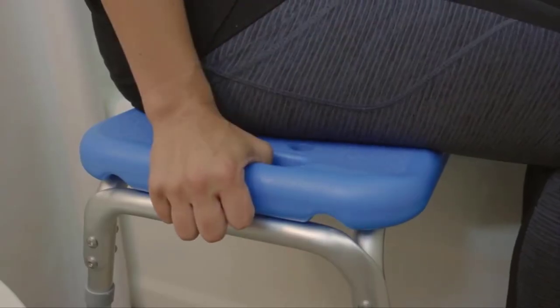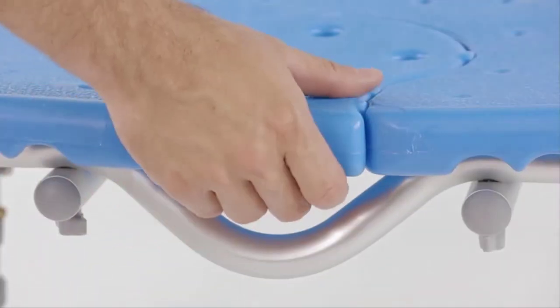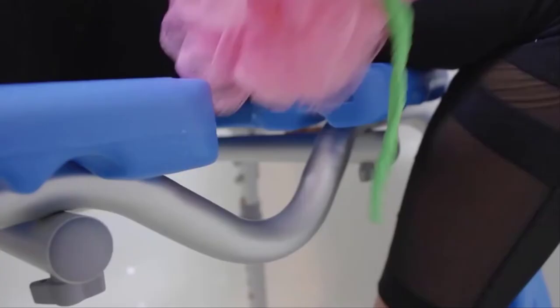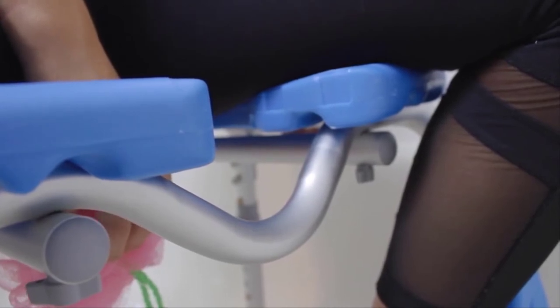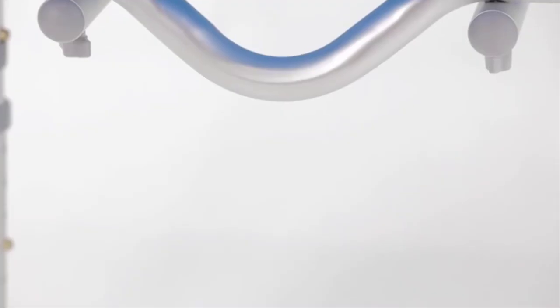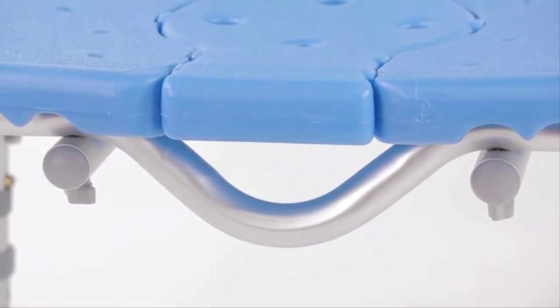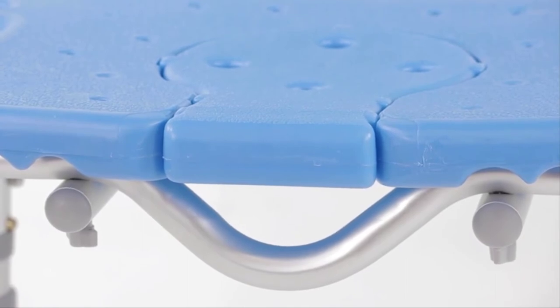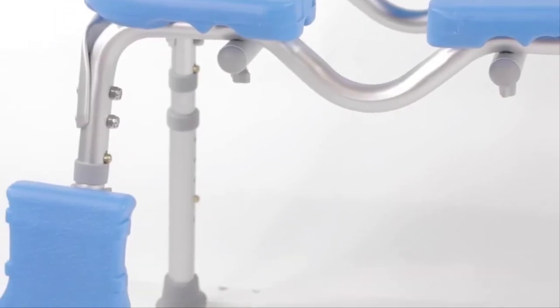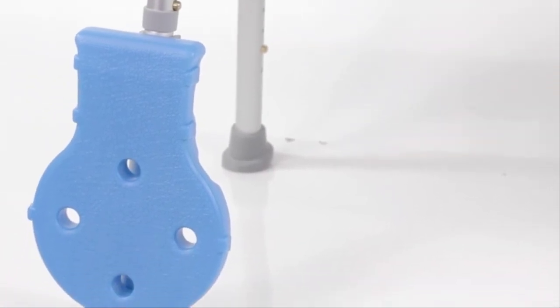Integrated handholds make the transfer process safe and easy. The seat base features a cutout with reversible insert to allow for superior access to the perineal area for effective cleaning. The industry-exclusive U-Frame design eliminates the frame obstruction found in other transfer benches for easy, convenient and dignified bathing. An integrated mounting bracket helps keep the insert section conveniently within arm's reach.